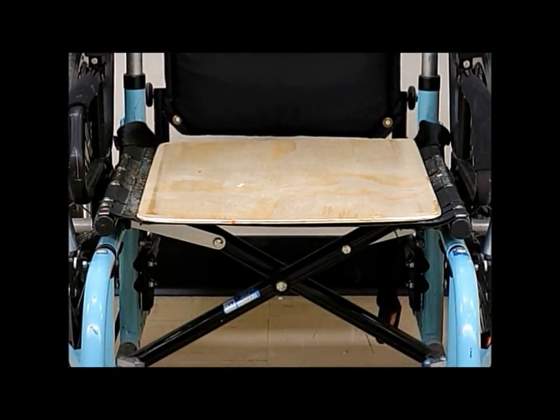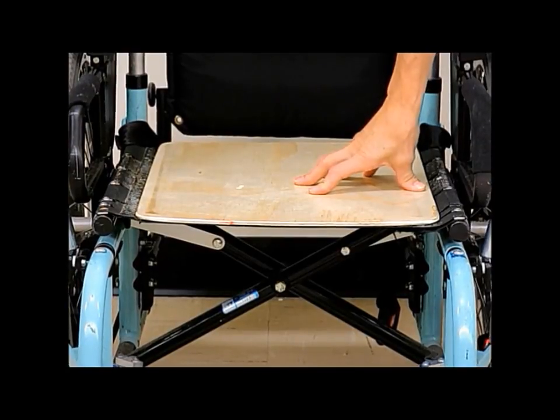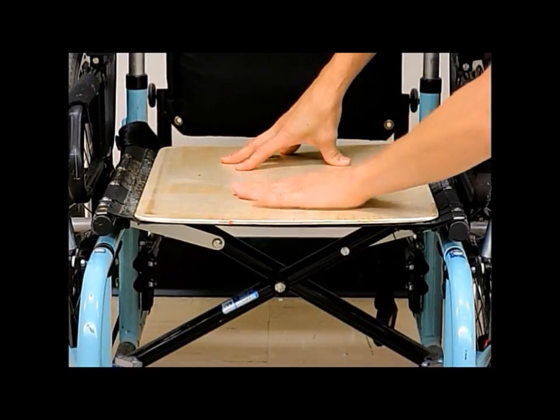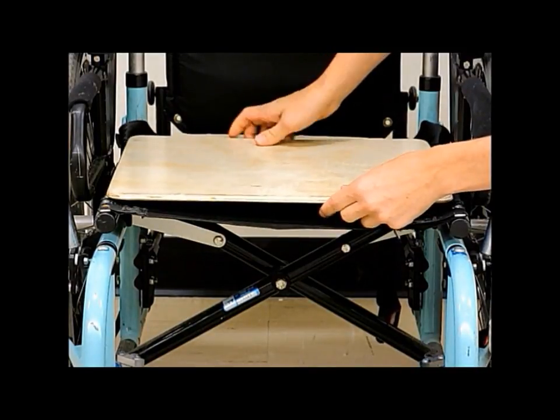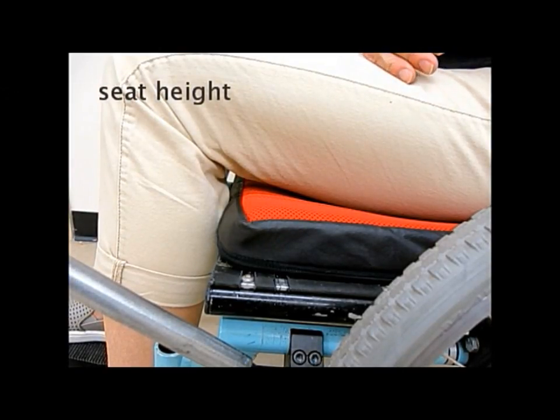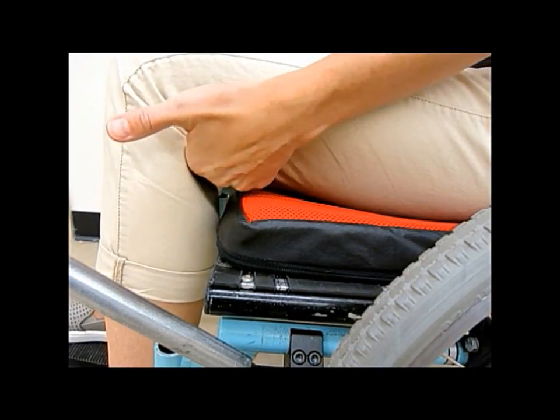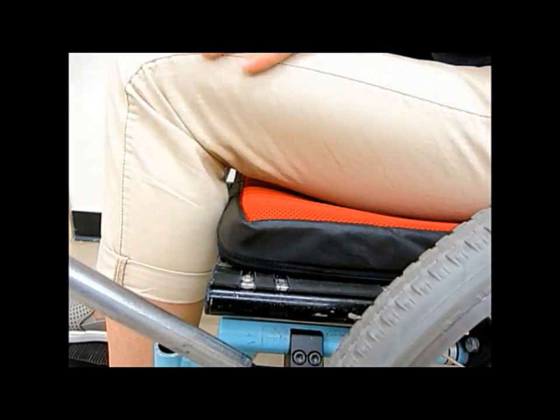A seat rigidizer will help with positioning, but tends to increase the seat height. So use a smaller rigidizer that fits between the rails rather than on top. So this is between the rails, and it still creates a firm base versus on top of the rails like this. Makes it up higher. For seat height, we found that the height of the cushion when sitting on it to the bottom of the shoe is 1.5 inches less than the measurement of the popliteal to the base of the shoe. This tends to allow for the most efficient pull, but needs to be assessed individually.